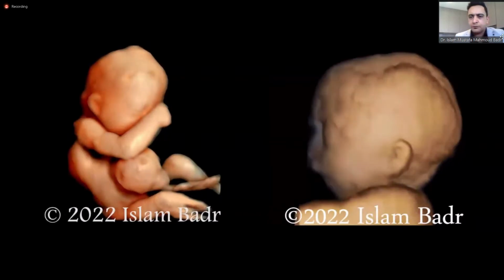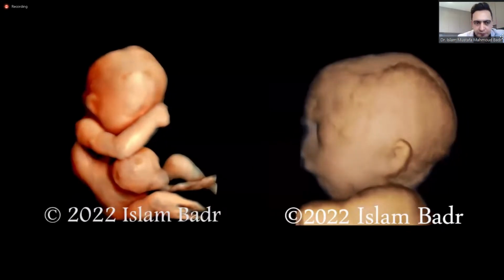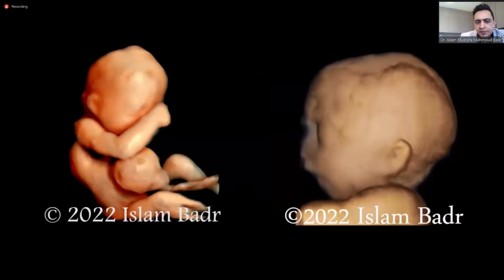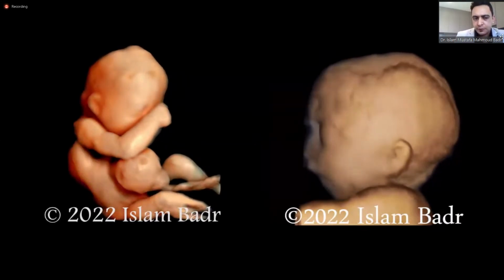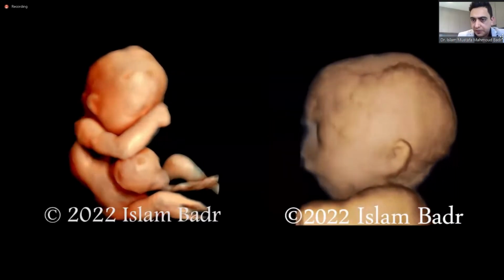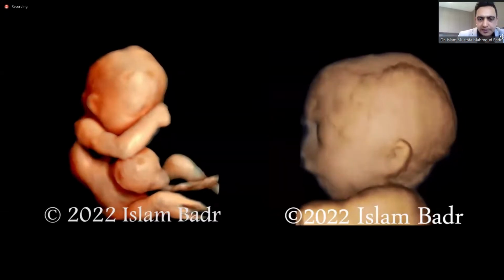To give an example from prenatal diagnosis, these are two cases. Imagine the case to the left side. It's very easy for you, even if you're not a doctor, to understand that there is something bulging out of the fetal abdomen. I don't want you to say that this is fetal omphalocele. I think it's already easy to know that this is fetal omphalocele. The pattern recognition in this case is very easy.